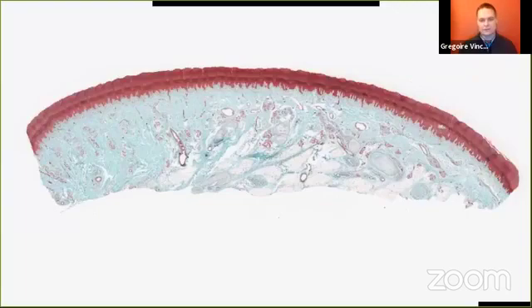And first, you have to stain it. Here it's a piece of the skin of your finger, for example. All the wavelets here are your fingerprints. In red, you have your skin, and all the green and pink parts are the tissue under your skin. It has been stained with Masson's trichrome to put some structures in evidence.